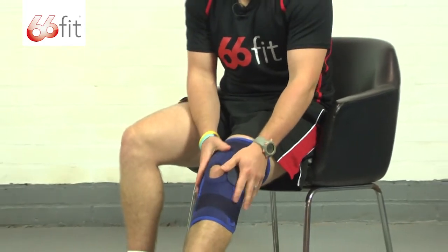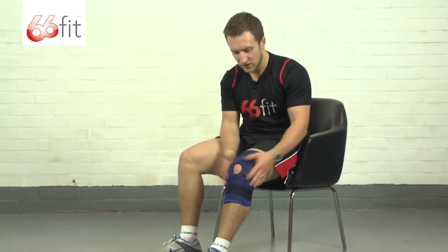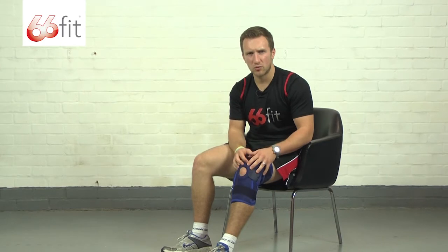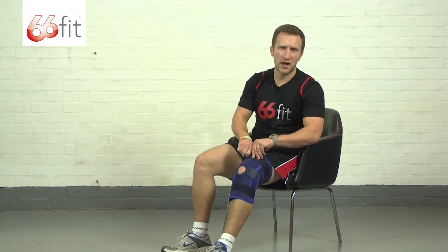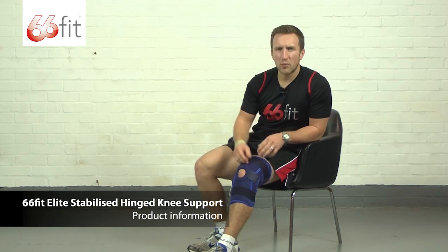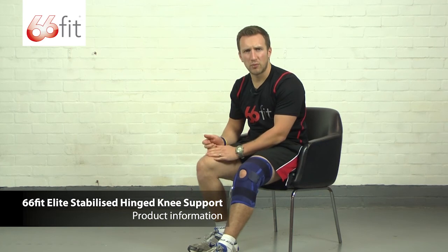The support itself is a very supportive knee brace. If you've suffered any injuries to your knee, this is great for providing plenty of support whilst walking about on a day-to-day basis or if you're going to do any light exercise whilst wearing it. It's a unisex support, so both men and women can wear it. You don't have to worry about buying a specific one for either left or right legs, as it can go on both. And it's a one size fits all product.